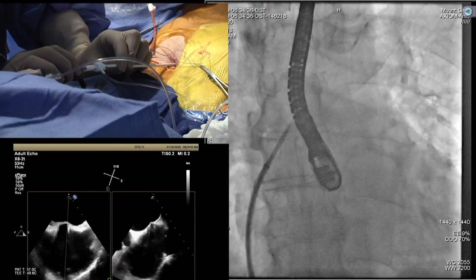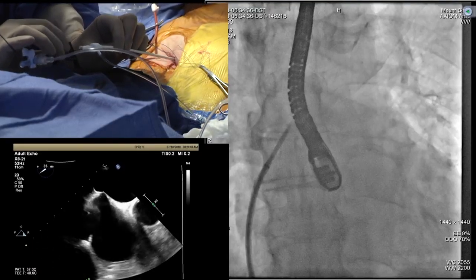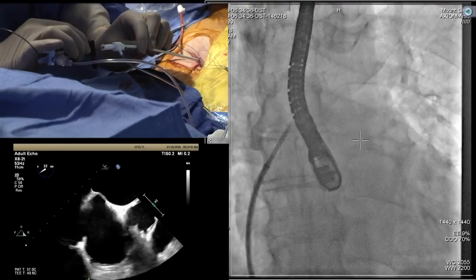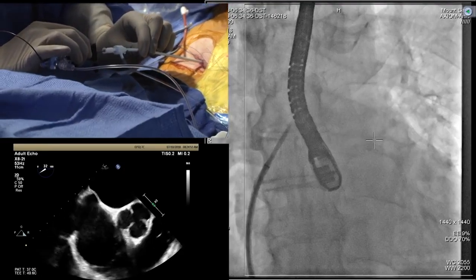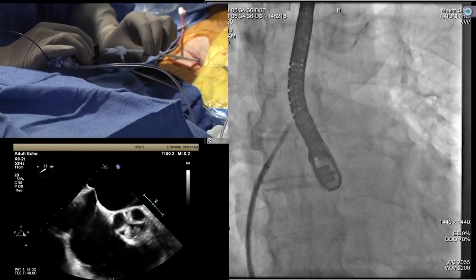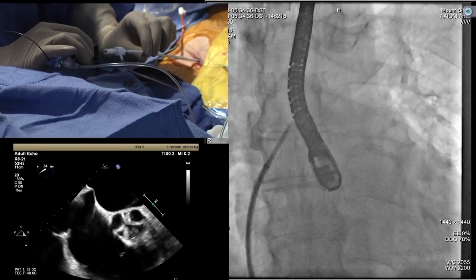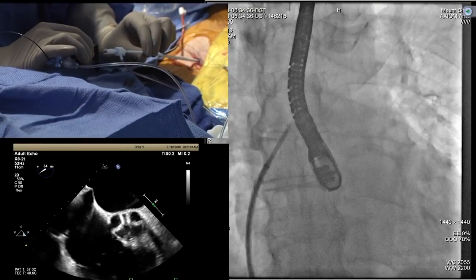You will go to short axis, and I'm going to go posterior. Can you see my hand movement? So I'm rotating a little posterior, a little clockwise movement. Yes, nice clockwise movement. Take me posterior. Good. Beautiful, perfect. We are stopping there. So it's nice and posterior, and we can get the height measurement, Gila.